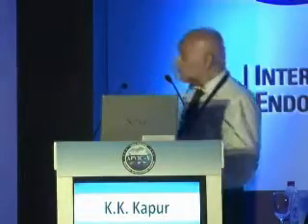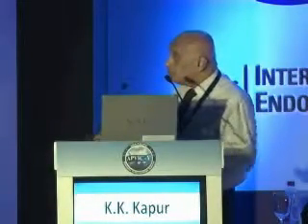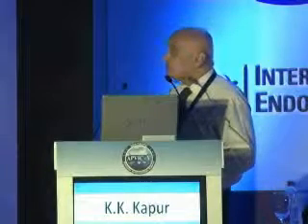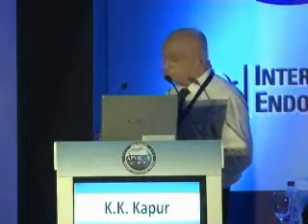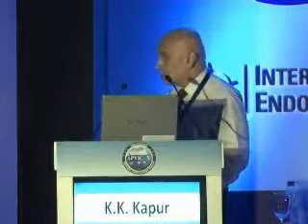So when you want to differentiate an acute versus a chronic thrombus, the acute DVT is not echogenic at all. So it's anechoic or hypoechoic versus a chronic DVT where it is easily echogenic. During the acute stage, the vein tends to expand, while in the chronic stage, the vein tends to become smaller.